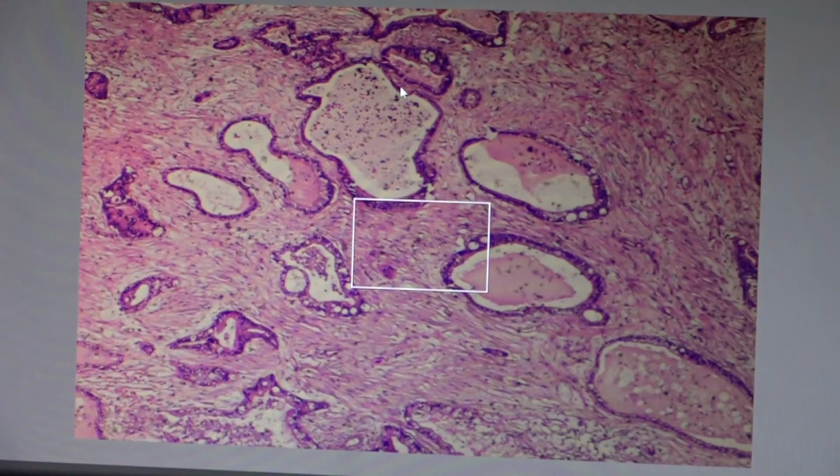This is another slide for the pathology of the female genital tract. It is adenocarcinoma of the uterus. The origin of this tumor is the endometrium. Malignant transformation of the endometrial glands results in formation of adenocarcinoma. The adenocarcinoma will result in invasion of the endometrium, myometrium, and may reach outside the uterus.